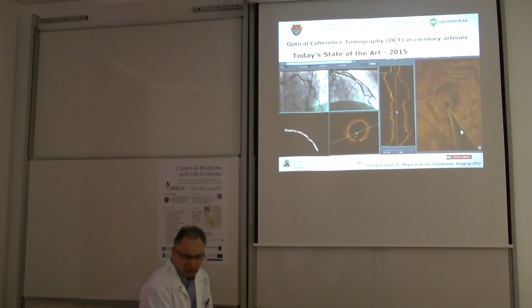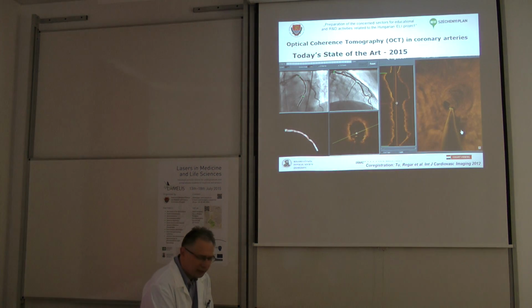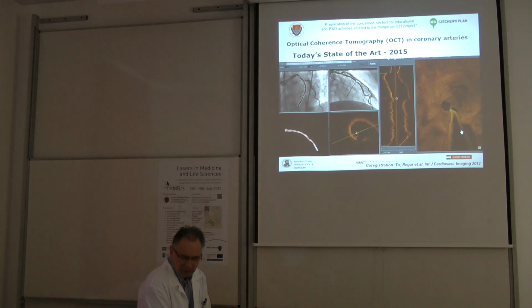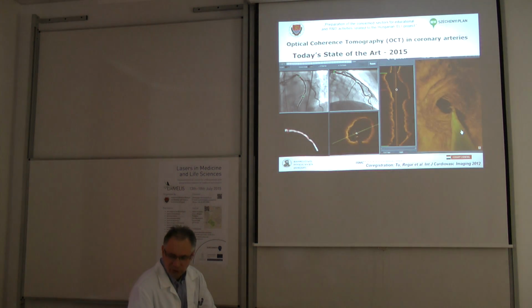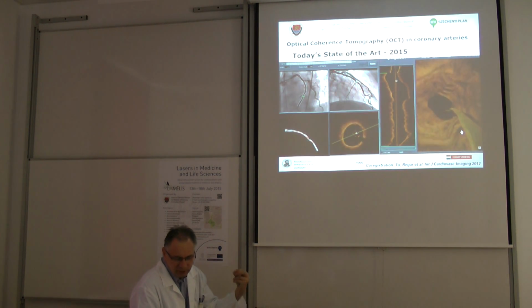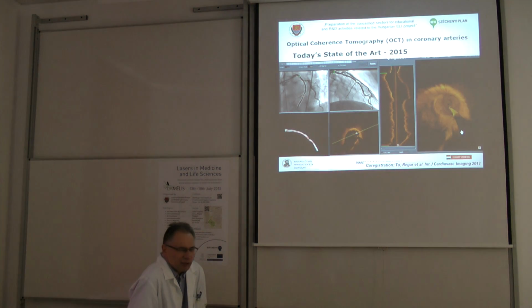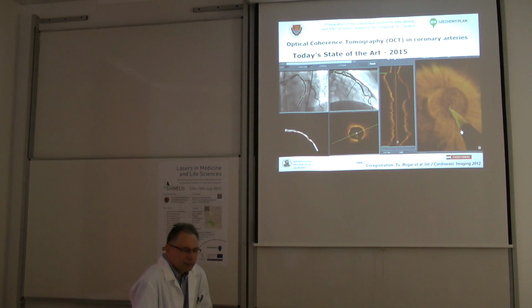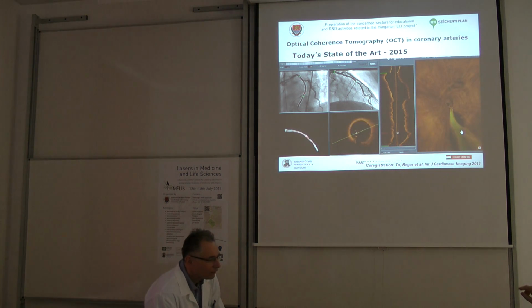So all intravascular imaging, OCT, or any kind of intervention, treatment, balloon dilatation, stenting, they are all tracked down on the top of this wire. How should I say this? It's a railing mechanism.